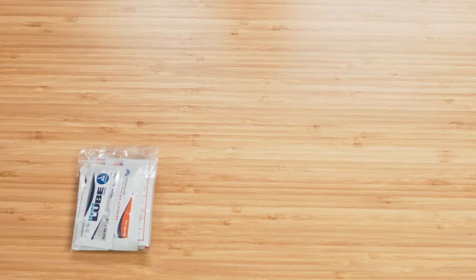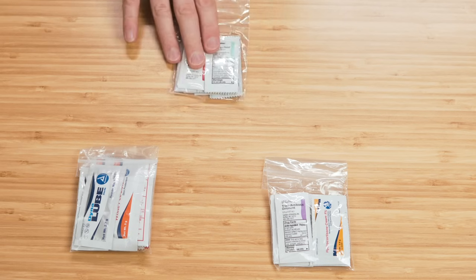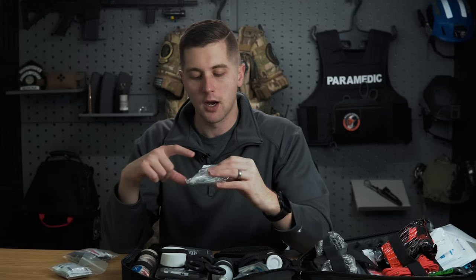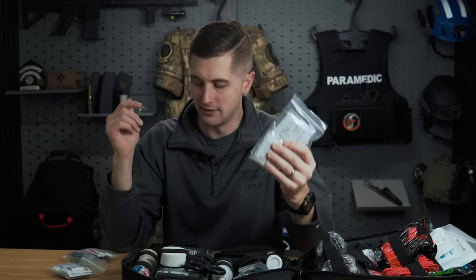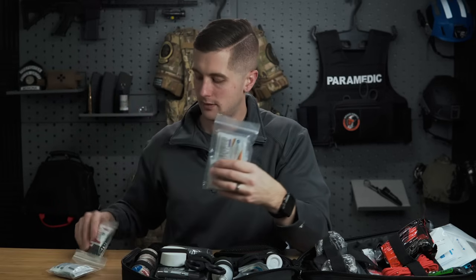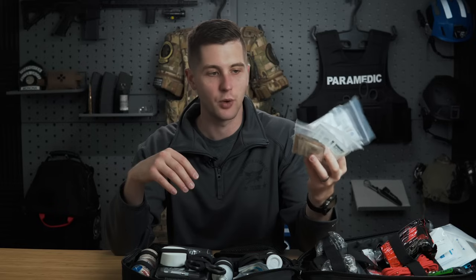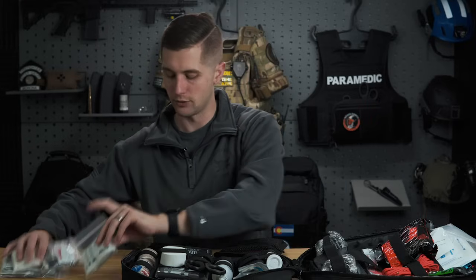And then last but not least, we've got things like lip balm, sunscreen, bug spray, more antibiotic, triple antibiotic ointment, hydrocortisone cream, anti-itch, oral pain reliever, all of that in this guy here. So really for medications for the things you might need pre-hospital, these are pretty good. This is what I'd probably keep on me and probably a little bit more. So you've got a little bit of anything you will need, to tell you the truth.